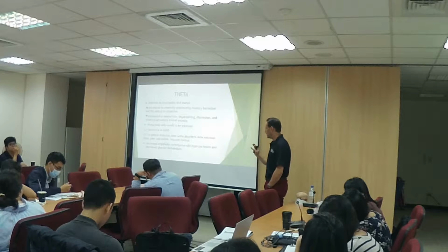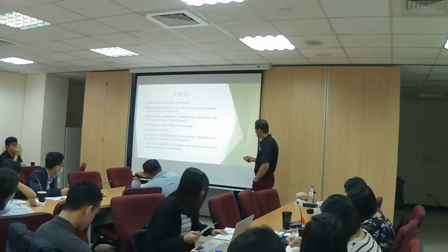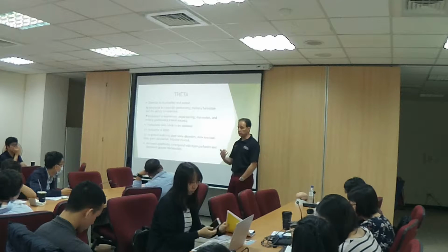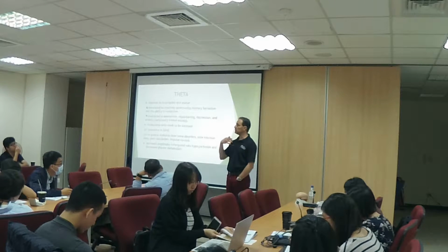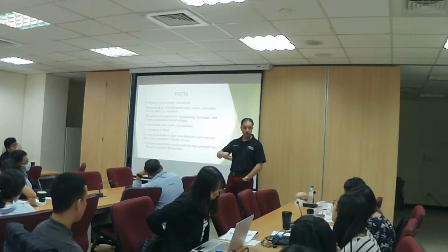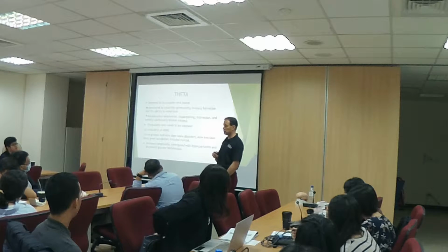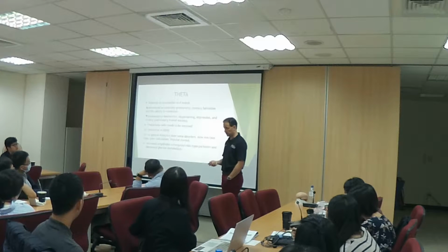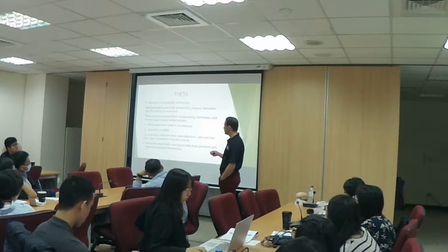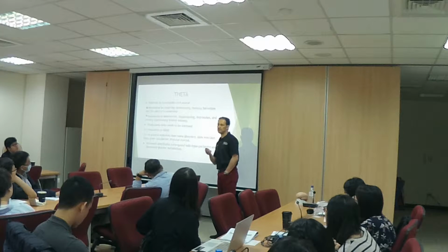Now, I want to say something important. Whenever I do a qEEG and I'm doing the interpretation for the client, or in a lecture such as this one, I never ever diagnose the person with labels. So I will never tell the person, you have ADHD, you have depression, you have anxiety.